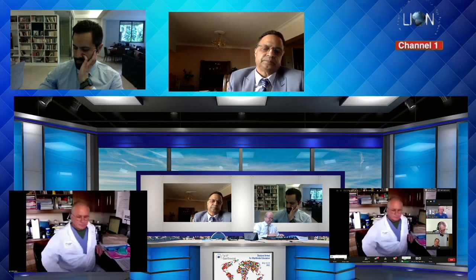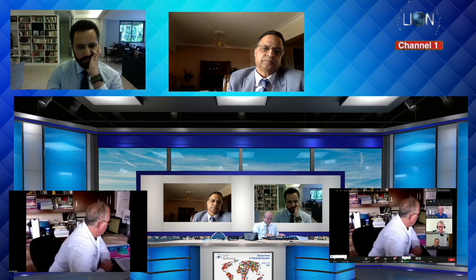That's pretty much similar to what's been described. So similar to the previous approach, but you're actually raising it off the anterior canal wall to stabilize it at the front. Really, you're making a bigger flap. Yes, and that way I have the graft up the canal wall and then the flap over that to really make sure I don't have an opening. Yeah, but you're doing that posteriorly.